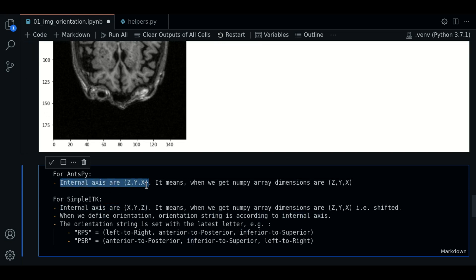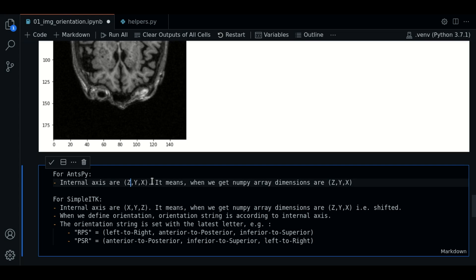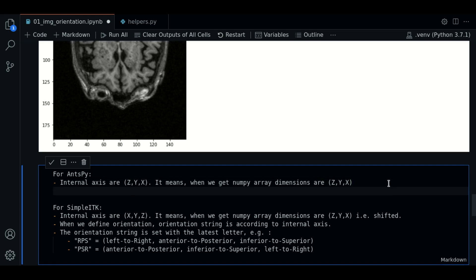For ANTSPY, we can say that the internal axes are Z, Y, and X. So this means that when we get the numpy array, the dimensions are going to be Z, Y, and X.